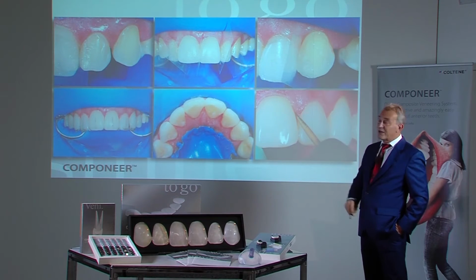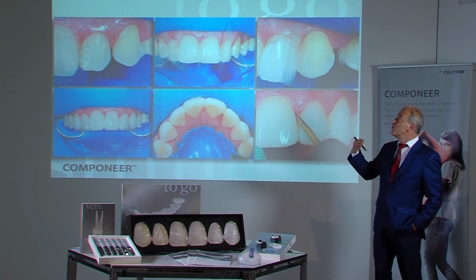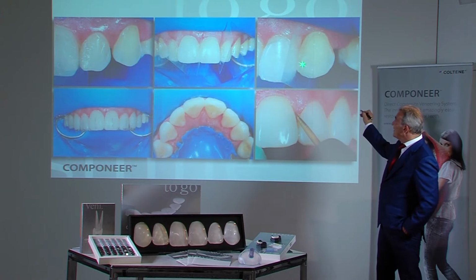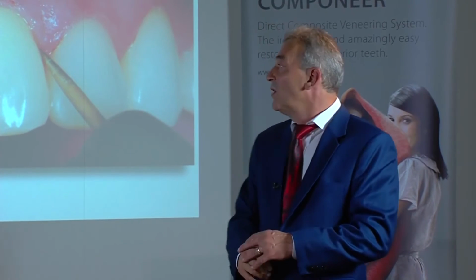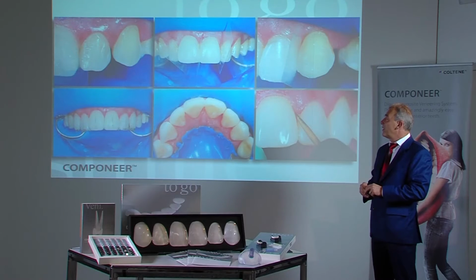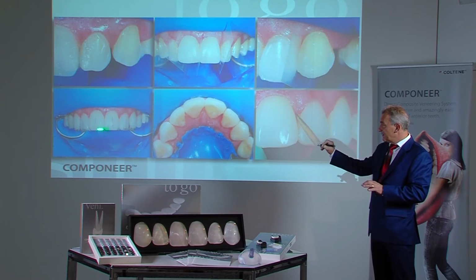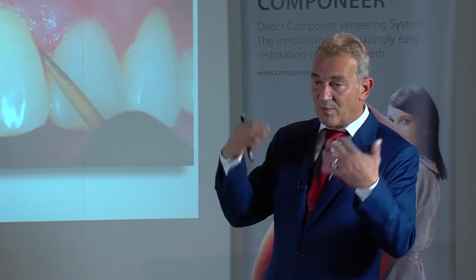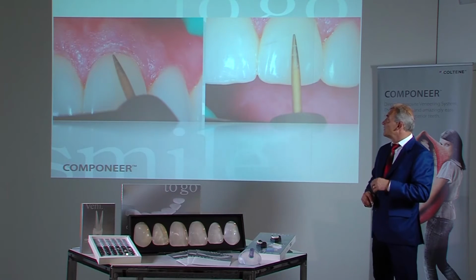However, we would not build up the 2 as this would otherwise become too wide. Instead, the 3 is built up mesially and thus shifted forward slightly. This allows retaining the proportions as naturally as possible. The incisal edges can be left as they are temporarily. Subsequently, they can be checked again, and any changes can be marked with a pencil and finished.